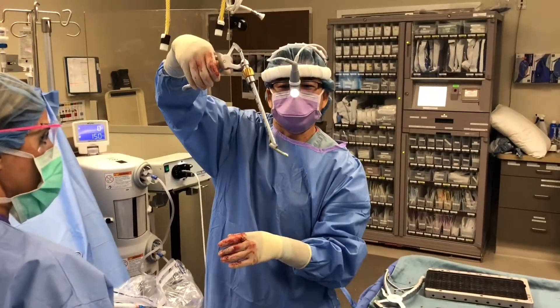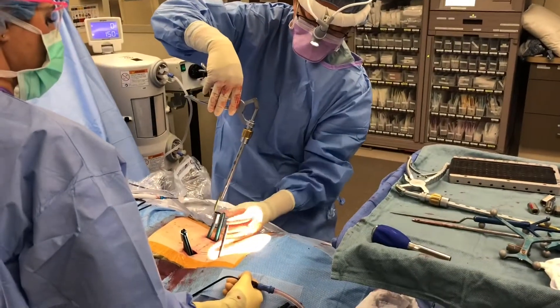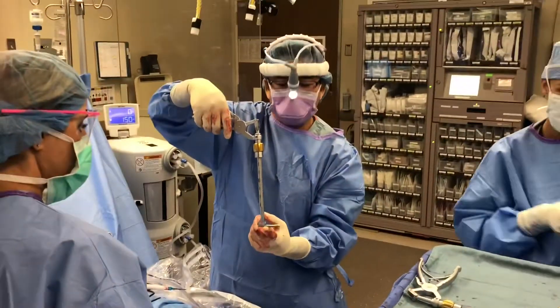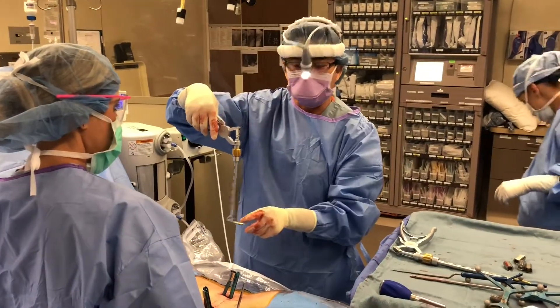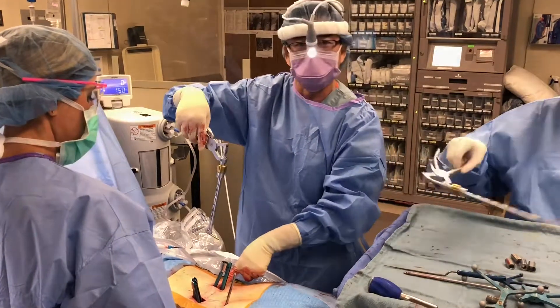We're about to pass the rod down. The rod is on this inserter and it articulates like this, so I can put it down this little tube above the skin, and then when it's at the bottom I will angle it back up and through these tubes, put the locking nut down, then disassemble all this. That's how the rod is passed through these little incisions without looking directly down there — that's how I can do this surgery with a small incision.